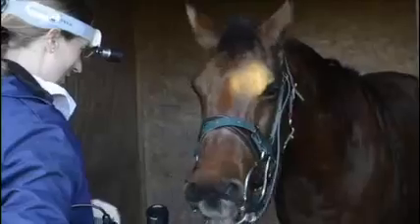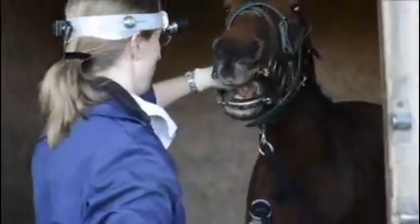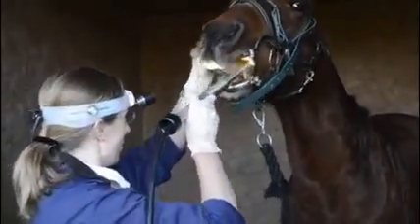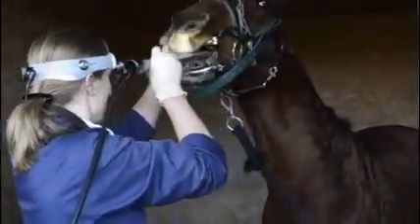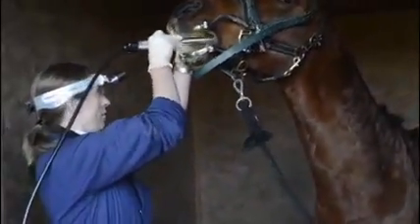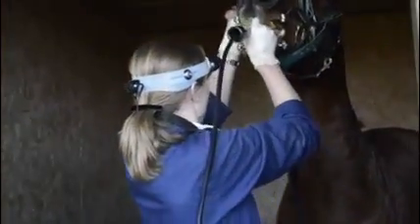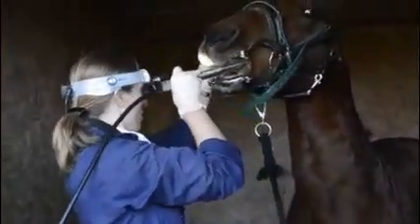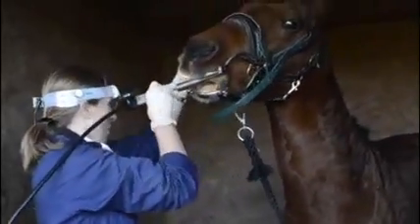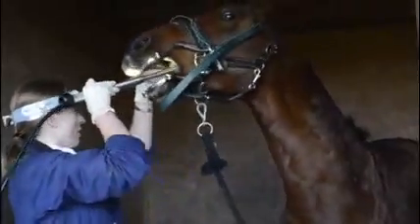Okay. I'm just going to hold your tongue. Ready? And keep it to the sides. It's going to disappear and see what he does. So just tease along basically. Good there. Good lad. That is a brave sausage. Yeah, well done. And by using the torch you can visualise what we're doing at the same time.